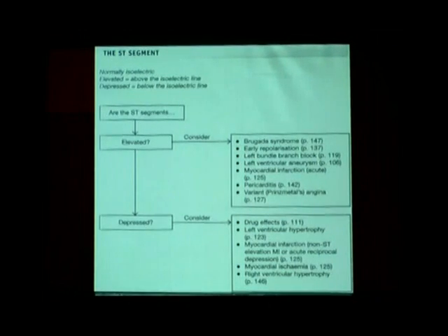When the ST is elevated, what is the diagnosis? Acute total occlusion, which is a subepicardial injury. Whereas when the ST segment is depressed, what is the diagnosis? Acute critical occlusion. What is the difference in treatment of choice?